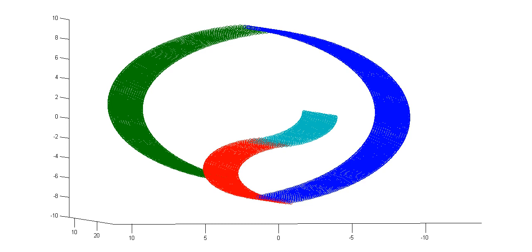And usually if you do this, you'll probably see in certain brain regions that all the different pictures of a dog show up kind of similar in the voxel patterns, and they are different from pictures of faces. And so you can get this matrix that says, according to this representation, how similar are these different images? And what people have done, especially Nikolaus Kriegeskorte, is to make those matrices with fMRI data, and then also make those matrices for models of the visual system. For example, deep convolutional neural networks that have been trained to classify images.